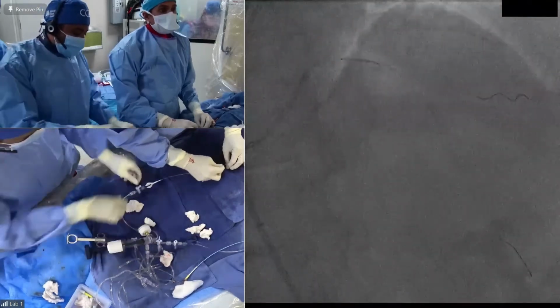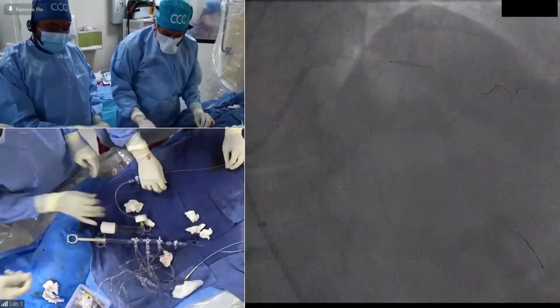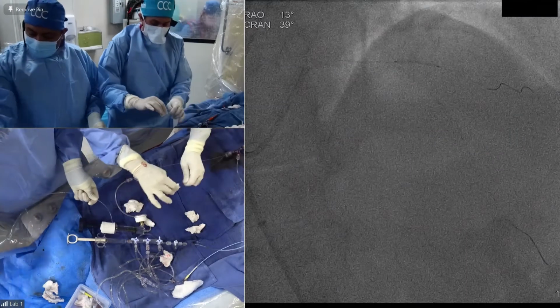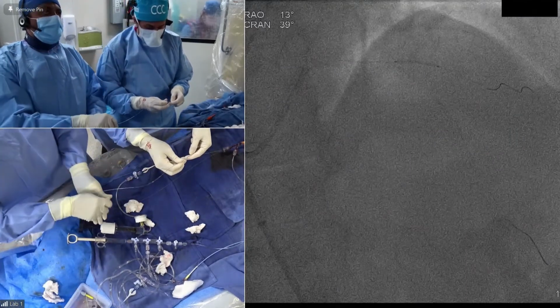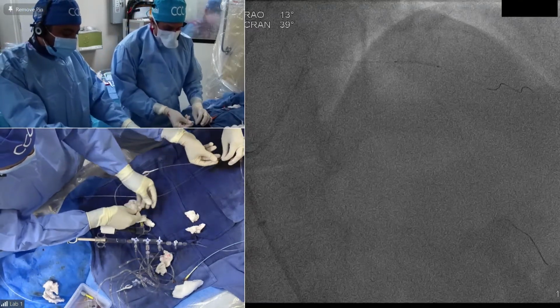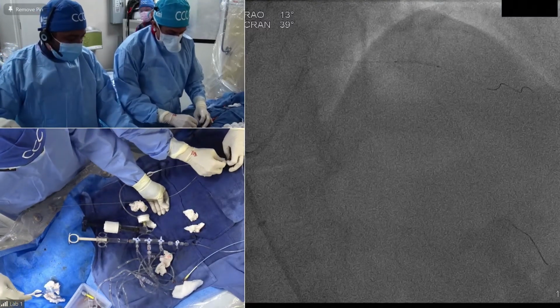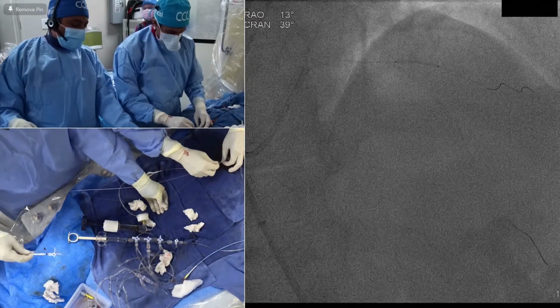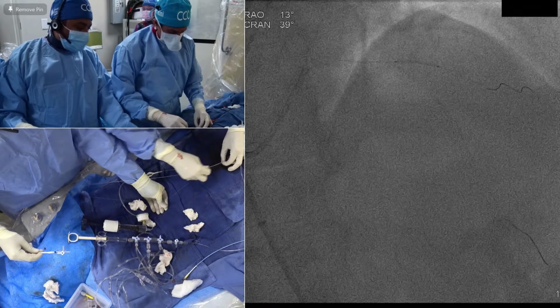So we are going to the side branch. Okay, good. And now main vessel. That's great. 4028 in the main vessel. All right, so then what we'll do is we'll deploy the side branch stent. That's a bit generous, a millimeter lengthwise. 28, yep. Definitely can't miss.